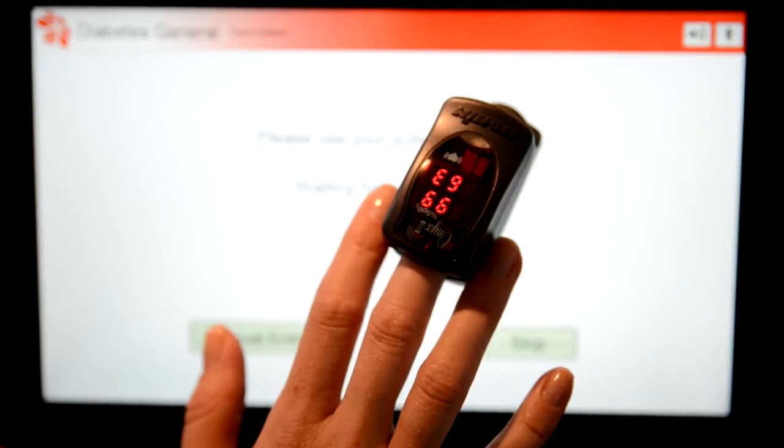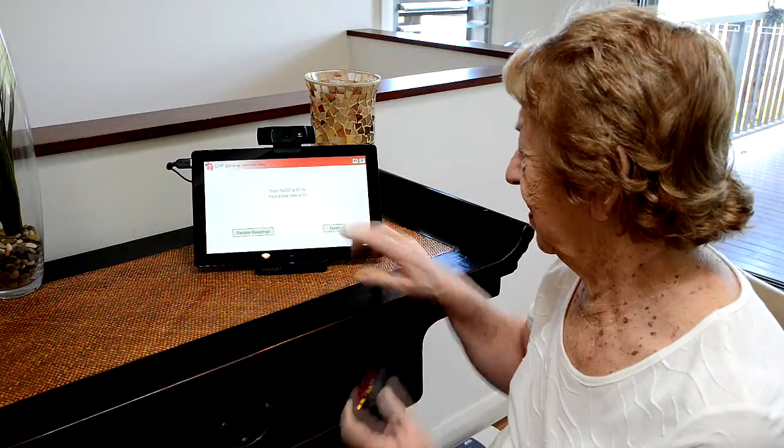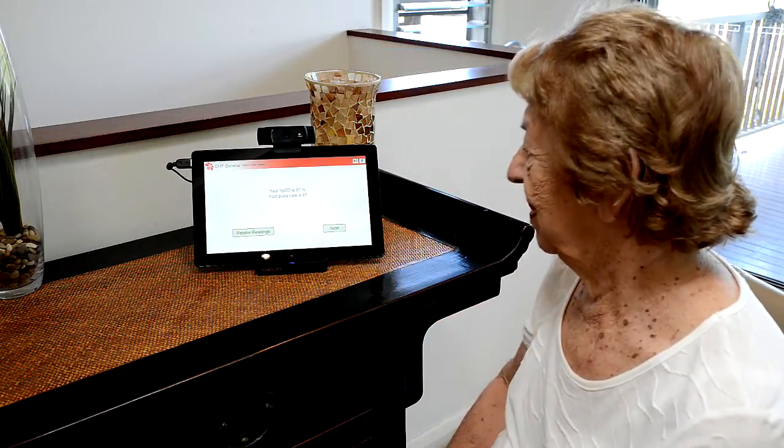Now wait for the Telehealth Hub to announce the measurement, then remove the finger sensor and press next on the Telehealth Hub.